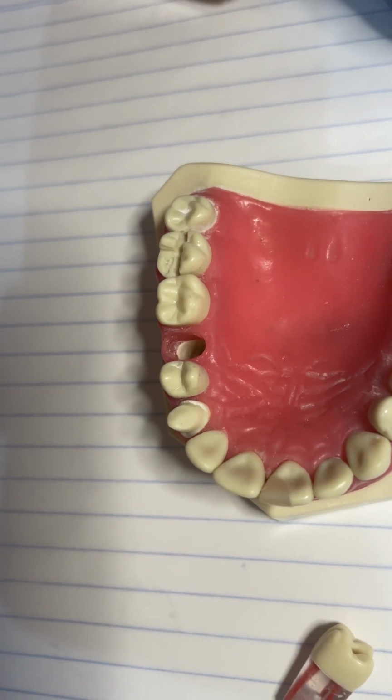All right. So, the most important step of root canal treatment, the mechanical effect of instruments over the root canal wall, may result in iatrogenic damage like transportation, zip or elbow, ledging, apical blockage, loss of working length, perforation, extrusion of debris, instrument fracture. So those are all the things that can happen if our access cavity is not proper, right? So our aim is to avoid those mishaps. That will actually be achievable if we do enhanced visualization of the root canal space by performing proper access cavity.